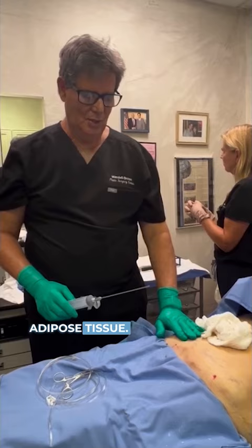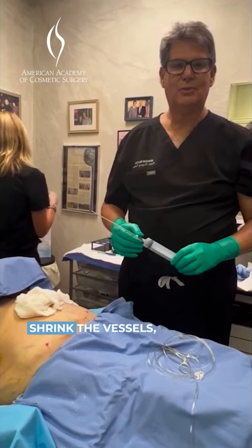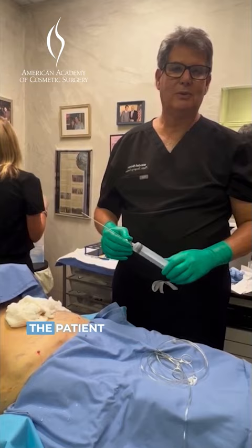So we're doing what we call syringe lipo. We've already numbed up the area with tumescent fluid. Tumescent means to fill out. We've used lidocaine and epinephrine to shrink the vessels, lidocaine to numb up the area, and a little bit of bicarb so the patient doesn't feel the acidity, which causes burning.